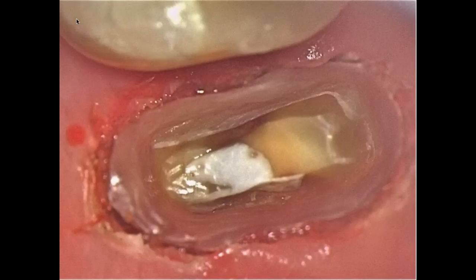Okay. What happens if the patient moves his head? So do you have to focus again, or how does it work for you? Of course, they have to focus again when patients move their head. But it's really only a problem when you work in the lower jaw, because when you close the mouth and open it again, you are out of focus. But then I just use a wedge, put it between the teeth, and the jaw is quiet, not moving.